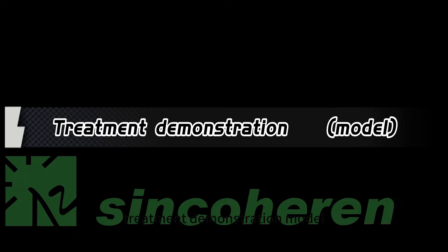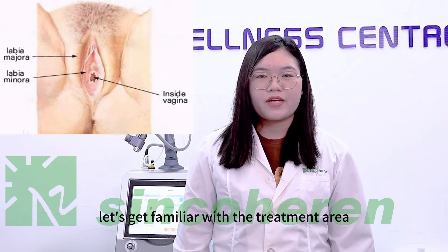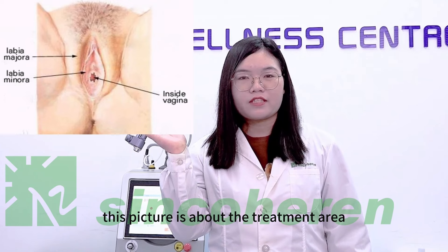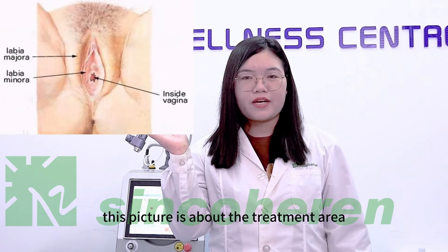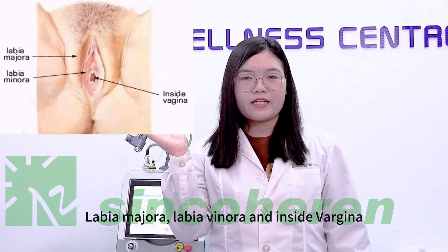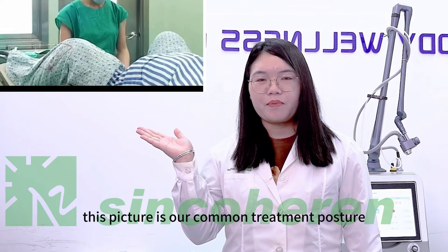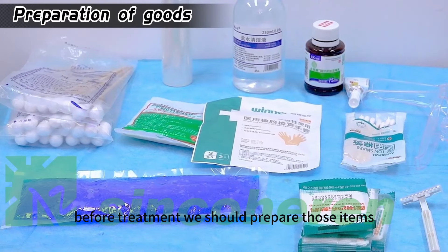This is a treatment demonstration model. Let's get familiar with the treatment area. This picture shows the treatment area: labia majora, labia minora, and inside the vagina. The next picture shows our common treatment posture.